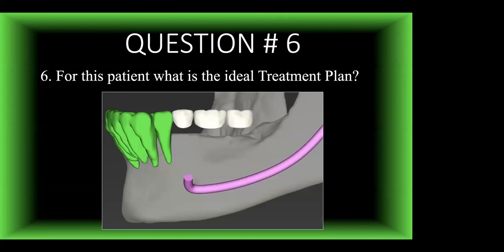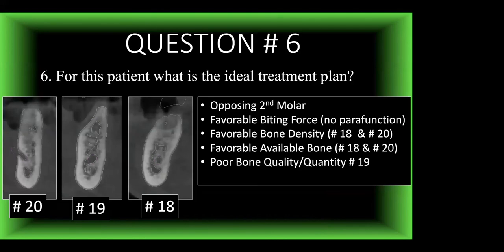So you always want to get away from treatment planning to what you're comfortable with. Okay, I only like to put 2 implants in, or the patient can only afford 2 implants, so I'm only going to do 2 implants. You look at all the factors, and that's how you stay out of trouble and you prevent complications and issues post-operatively. So let's go into a question here.